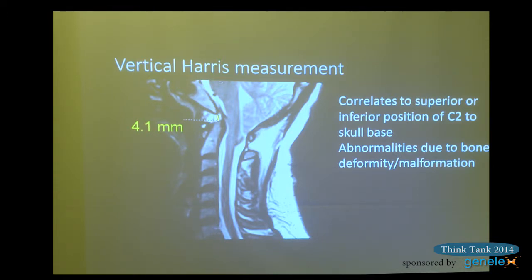If the tip of the odontoid is up too high, that means the skull base has moved up, or the cervical spine has moved up into the skull base. This angle was developed really for trauma because it's something that can be seen on x-rays on a lateral projection, and if it's more than 1.5 centimeters, there's got to be a big ligamentous injury across from any normal variant.